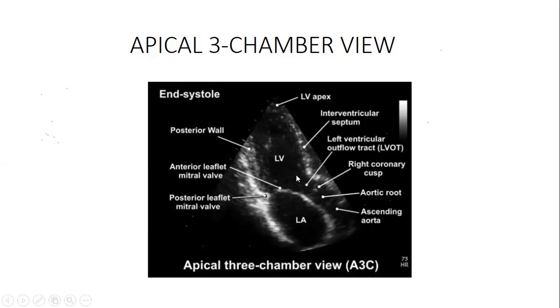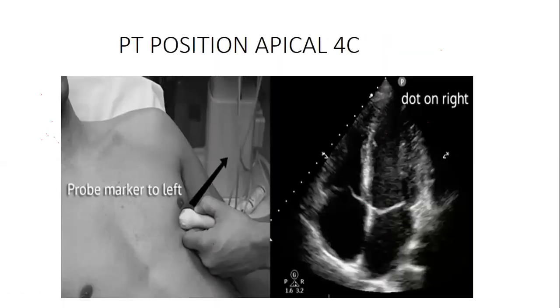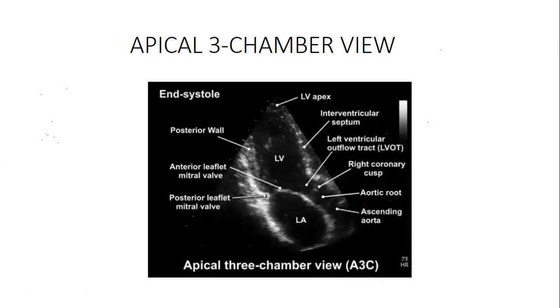So there are times you can't appreciate it nicely in the apical view. Open it. Look at this. Okay, I cannot see the aortic root here. But with this same view, I can modify it to have this. I can have this one practically, depending on how you orient your probe. So your key is to have a 4 chamber view nicely, well done. This is practical.